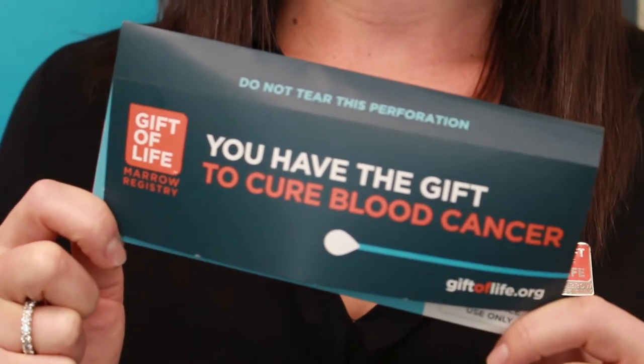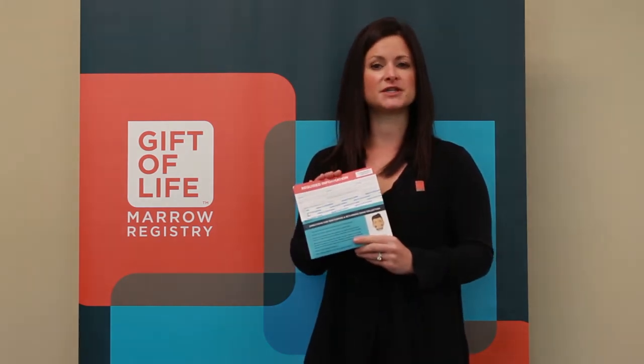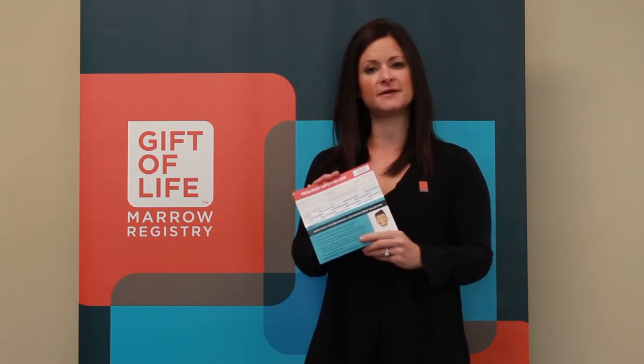Hi, I'm Marty Freund, Director of Community Engagement at Gift of Life Marrow Registry, and this is how you swab. Swabbing is simple and requires taking a sample of cells from the inside of your cheek. The first step will be to complete the required information located on the top portion of your kit.